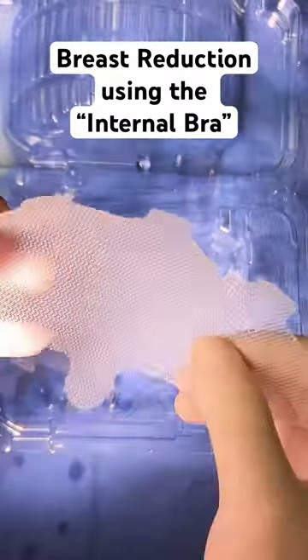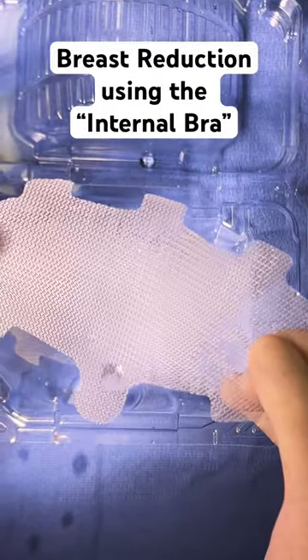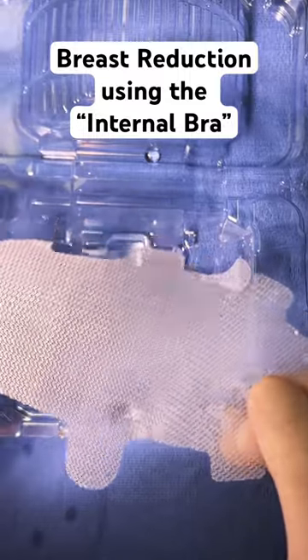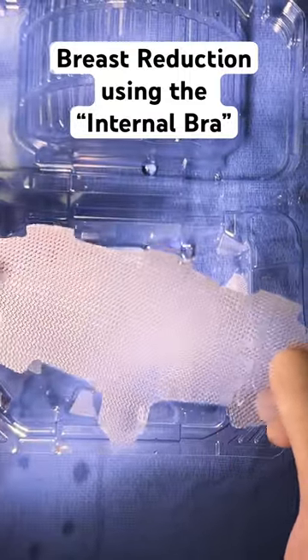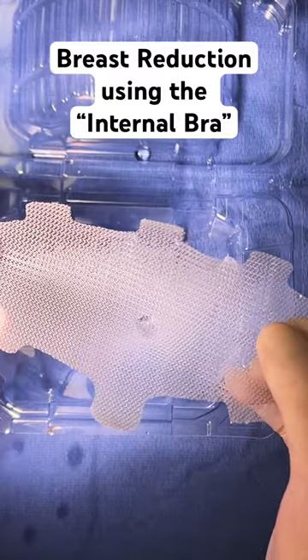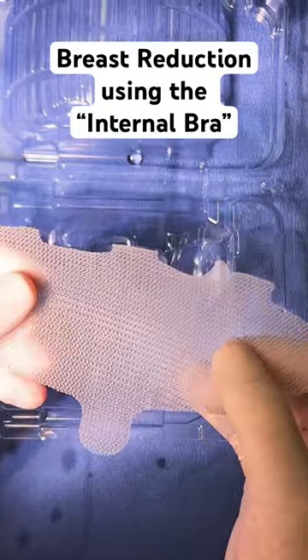We're using it to support the pedicle or the breast tissue so that with time, as the skin and breast tissue stretch, this is going to serve as our scaffolding. It's going to completely resorb by 18 months, and as it resorbs, it releases growth factors that produce collagen that are going to strengthen the tissue.